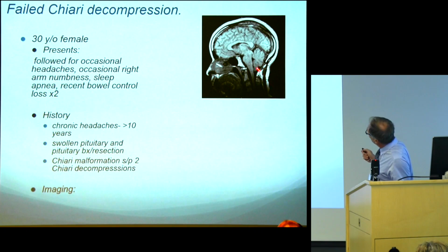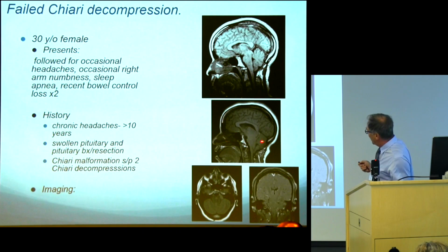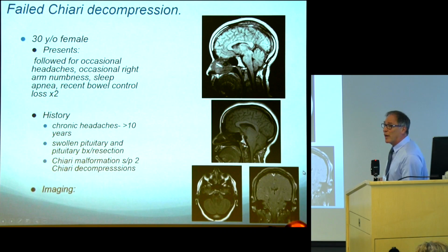I was at first thinking, well, maybe she needs a duroplasty or cranioplasty for some support. It's quite a wide decompression. Then she got an MRI, and you can see her now. Her brain is practically falling out of the bottom of her skull here. It's also herniated downward into the infratentorial region. There's tentorial herniation. You see tissue on the side here.